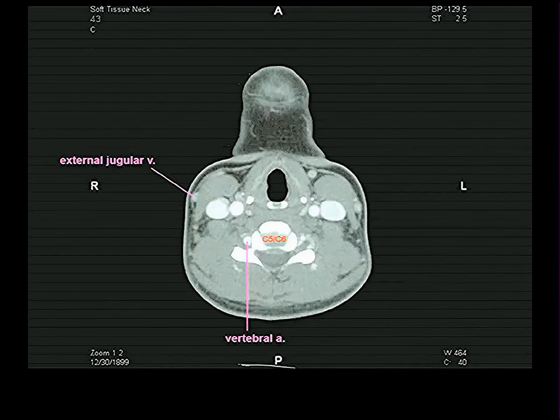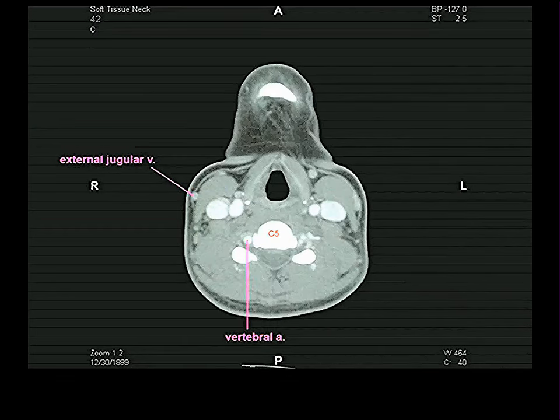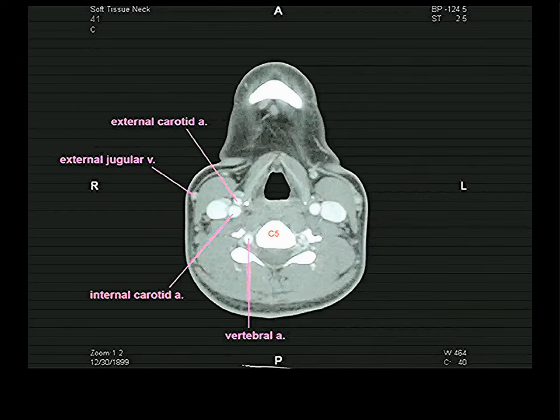This is what I wanted to emphasize. When I get here, I'm at C5, C6. I look at my common carotids. This is low. That's fine, common carotid fine, internal jugular vein, but doesn't this common carotid look odd? The reason it looks odd is because we cut it right at its point of bifurcation. This is pretty low for a bifurcation of a common carotid. It's usually up around C3, 4, but these things can do whatever they want.